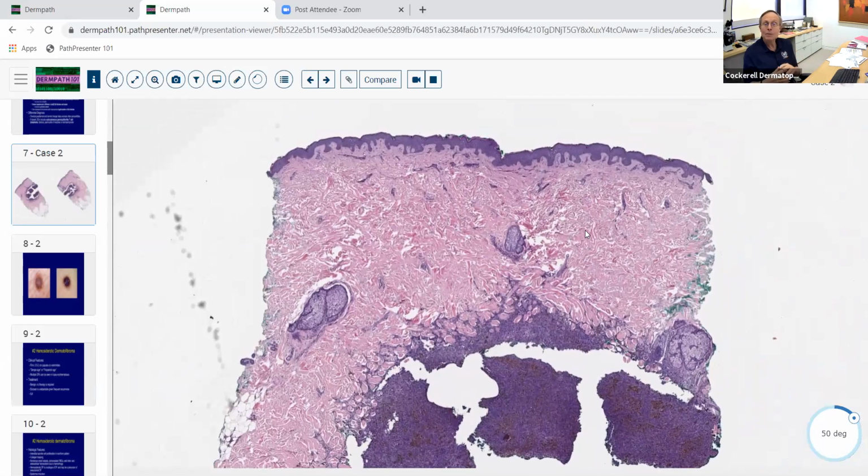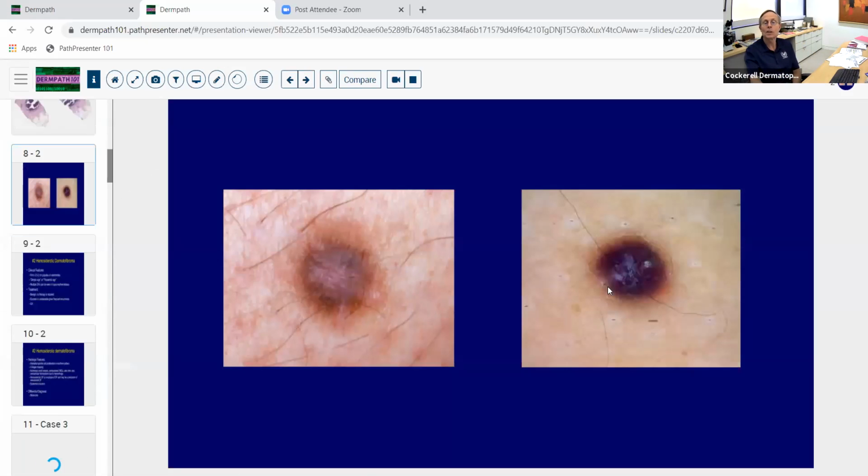And these kind of larger lesions that are more cellular, that can have a lot of extravasated erythrocytes in them, are almost even called an aneurysmal dermatofibroma. They're often seen around the ankle, the lower part of the leg, and some people actually refer to that as the so-called ankle type of dermatofibroma. So anyway, that's an example of a cellular hemosiderotic dermatofibroma.